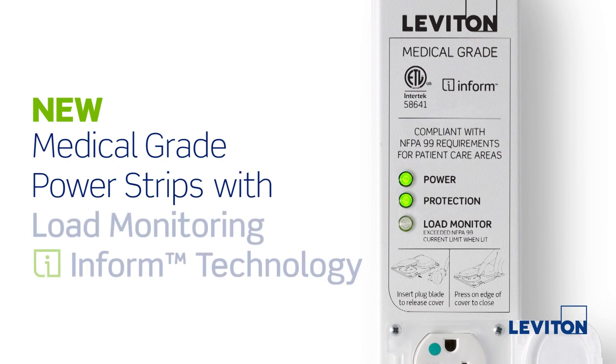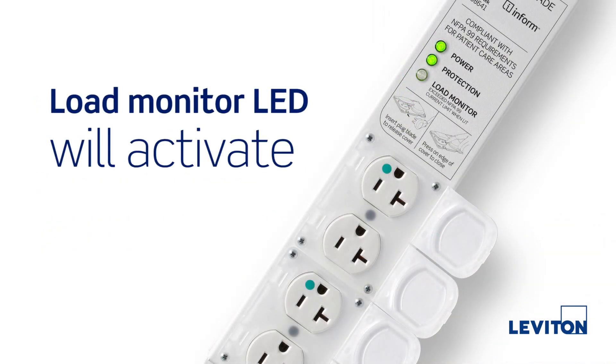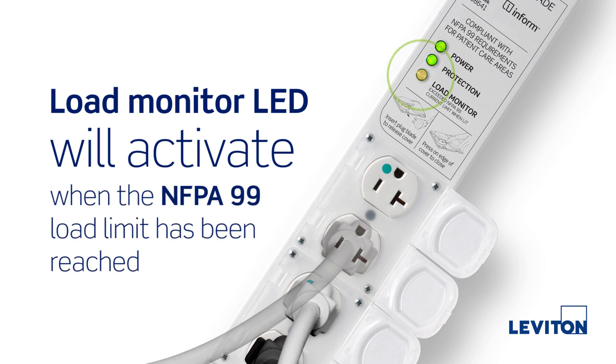New Medical Grade Power Strips with Load Monitoring InForm Technology. The Load Monitor LED will activate when the NFPA 99 load limit has been reached.